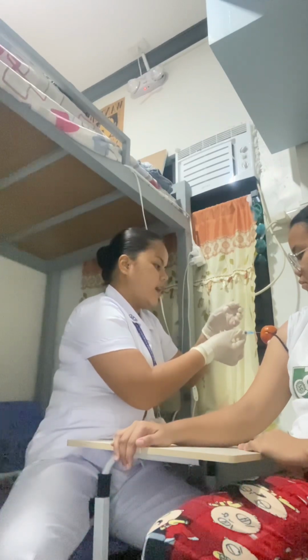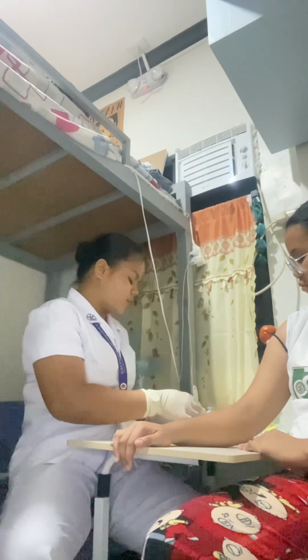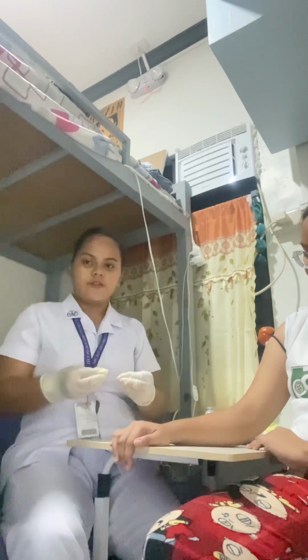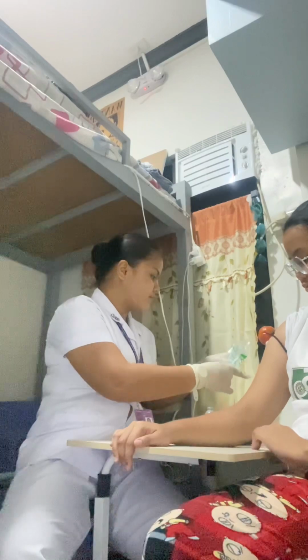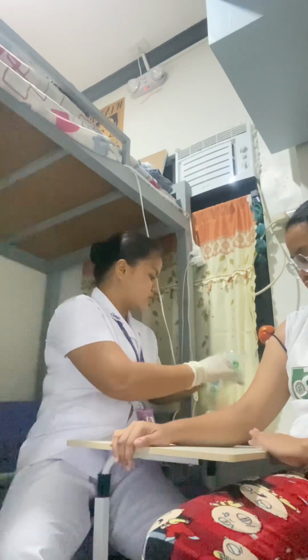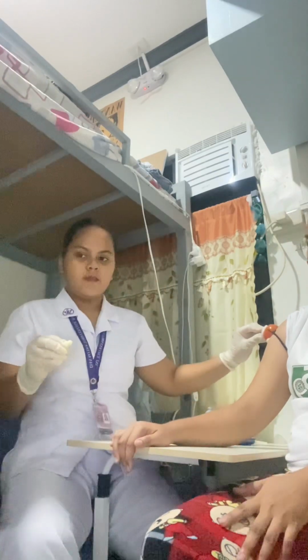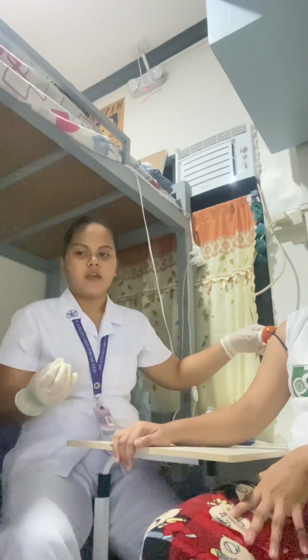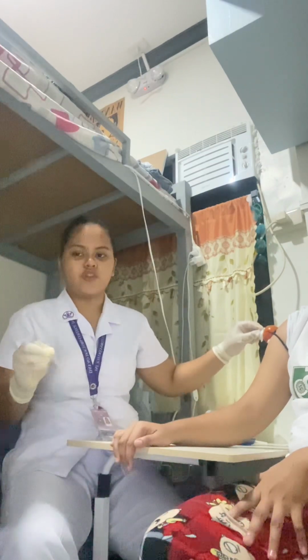After that, slowly, I'm going to remove the needle and cover it using a scoop method. This is to prevent a needle stick injury. If bleeding occurs, we have to apply a little pressure to stop the bleeding. But bleeding rarely occurs. And then we have to make sure not to massage the site of injection.